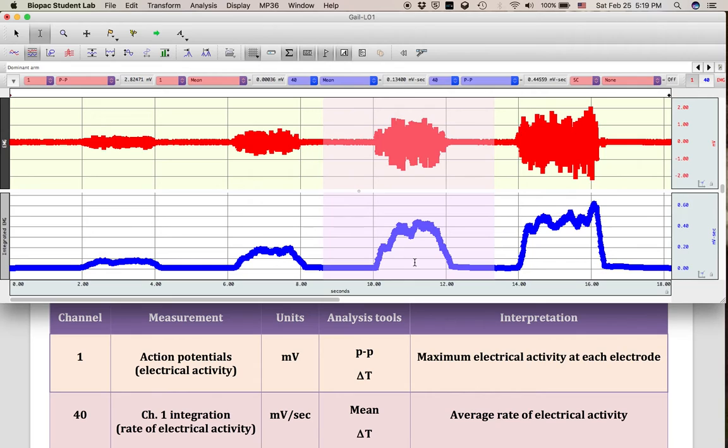Regarding channel 40, it's very important that you only highlight the given clench effort because this is taking an average in our mean analysis tool.